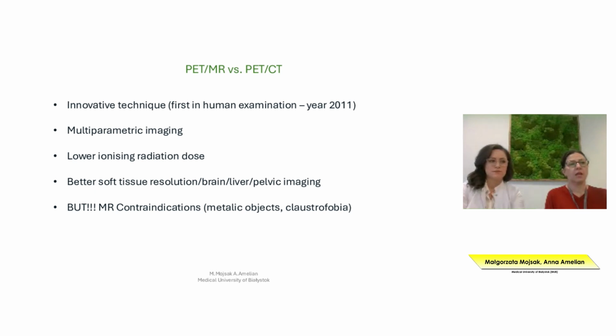before the scanners were developed, there were discussions whether PET-MR is going to replace PET-CT. What's the share of PET-MR in the hybrid imaging? So PET-CT, it was decided that these two techniques should complement each other.